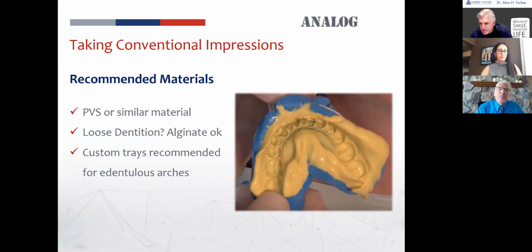So I'm sharing with you things that we call nSequence, because it really is a sequence of steps to follow. And I can promise you, after years of doing this, that when you follow the sequence, the results are pretty predictable. The tendency many times for clinicians is to want to skip a step, take shortcuts, or modify steps. We still can make it work.